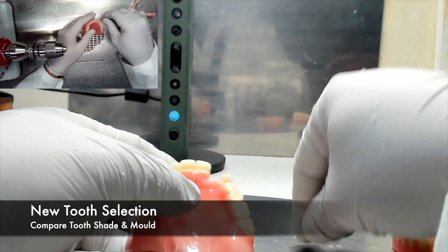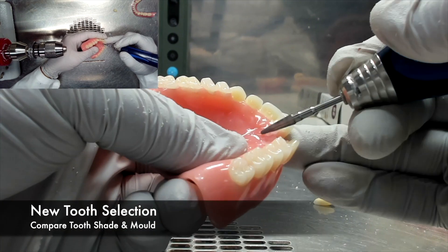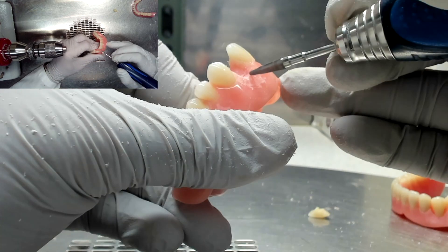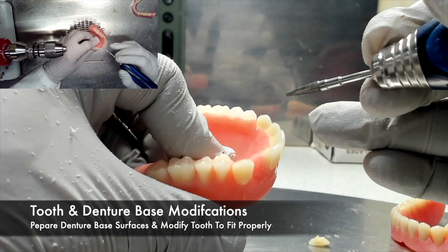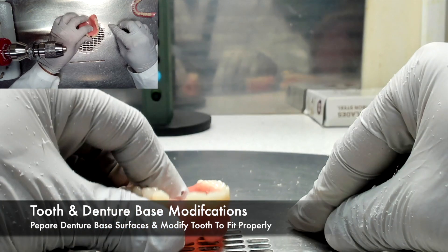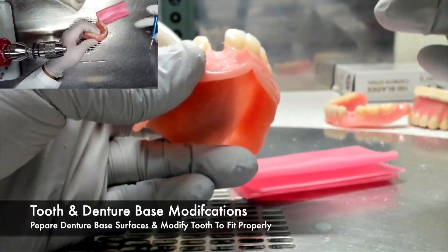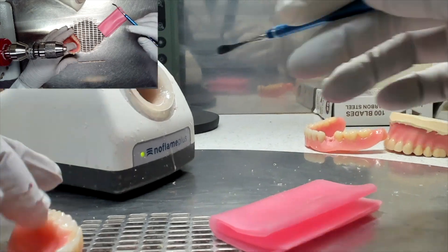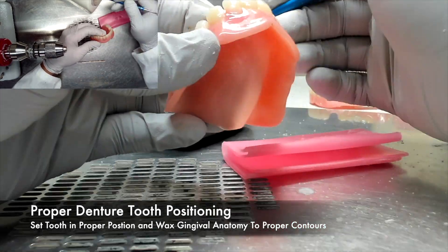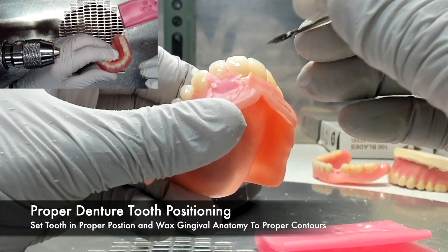As before, the first thing you want to do is select a new tooth. It must have the proper tooth shade and mold to match the pre-existing denture teeth on the arch. The same techniques are needed when using a matrix in that the denture base surfaces and the tooth need to be modified and prepared to fit properly and receive new acrylic. When using a matrix, the tooth must be positioned in wax. Not only must the tooth be positioned properly, but the gingival anatomy needs to be waxed to proper contours as well. Think about it as almost setting teeth all over again.